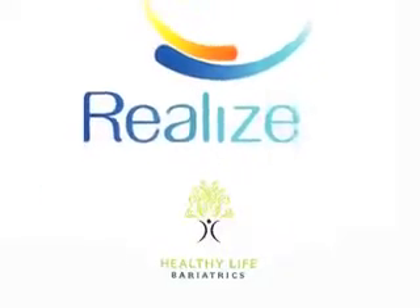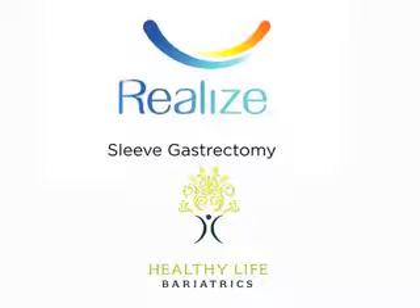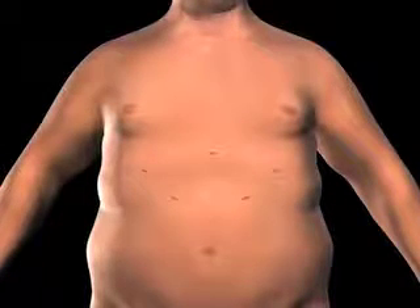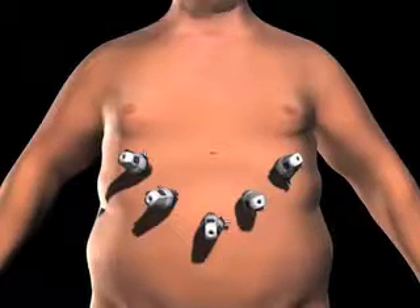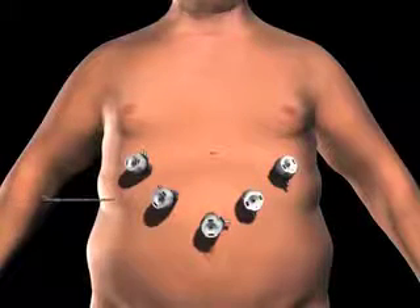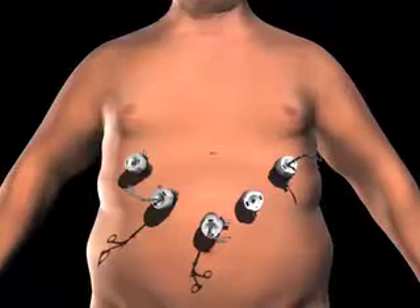The sleeve gastrectomy is a restrictive procedure, which limits the amount of food you can eat by reducing the size of your stomach. To gain access to the abdominal cavity, small incisions are created on the abdomen. Trocars, which serve as passageways for the surgical instruments, are placed into the incisions. Surgical instruments are passed through the trocars to access the abdominal cavity. The surgeon examines the abdomen using a laparoscope or video camera.